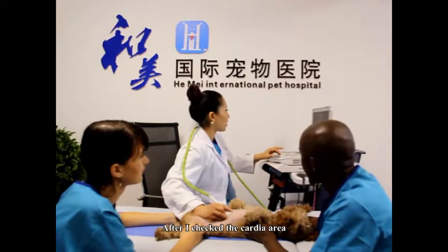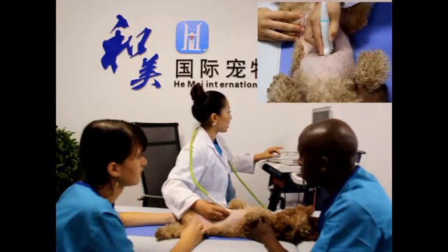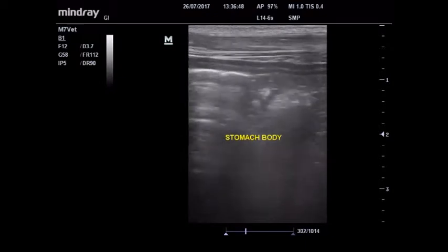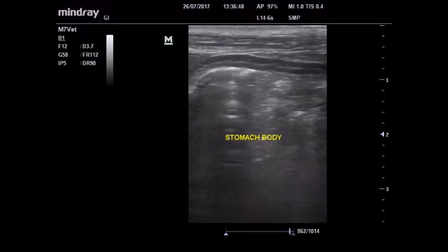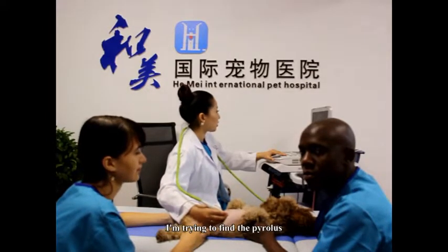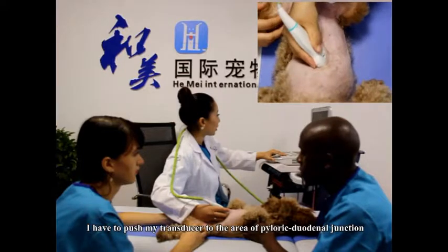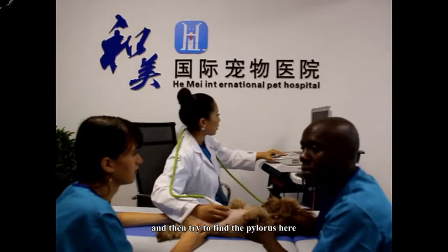After I check the cardia area, I move the transducer a little bit back and check the body of the stomach, and here is the body of the stomach. After I finish checking the body of the stomach, I try to find the pylorus. To find the pylorus, I have to push my transducer to the area of the duodenal pylorus junction, and then try to find the pylorus here.